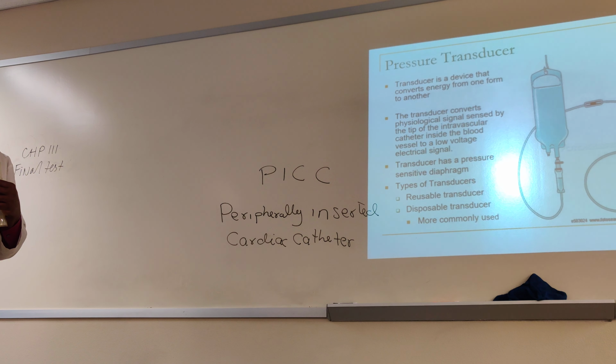But now they have disposable ones: once you discontinue a patient, you just dump it in dirty equipment and get a new one for another patient. They are cheaper now than they used to be, so what is currently being used more is the disposable kind of transducer. All of these here will be thrown away. You are no longer reusing it on patients like before.